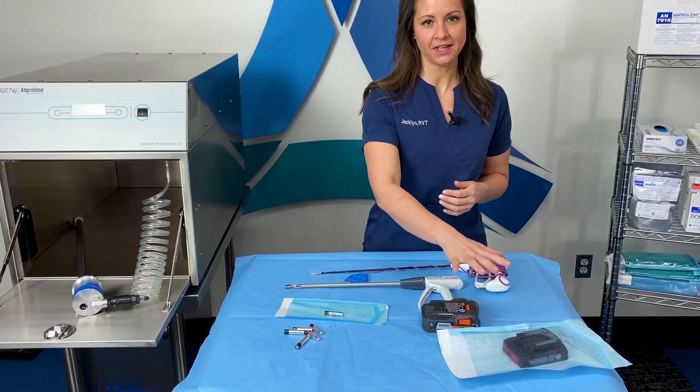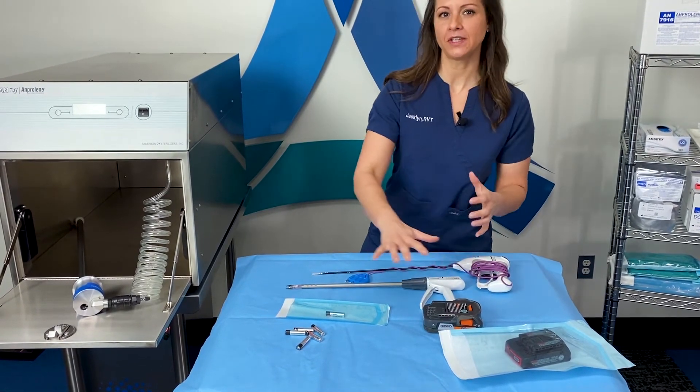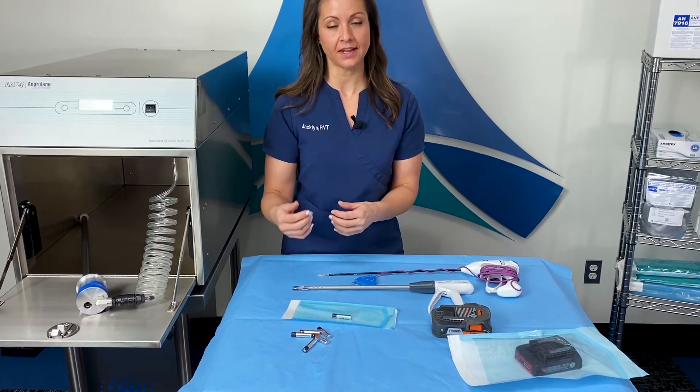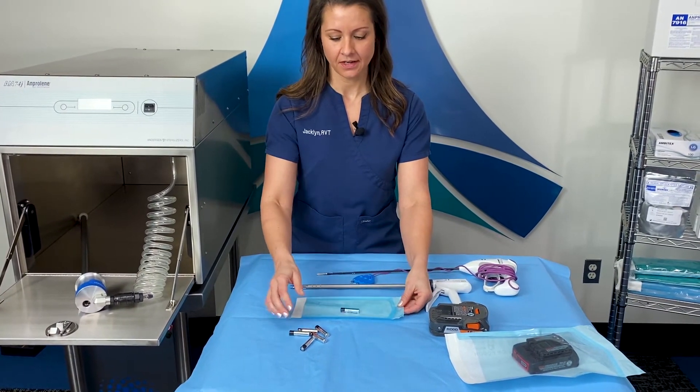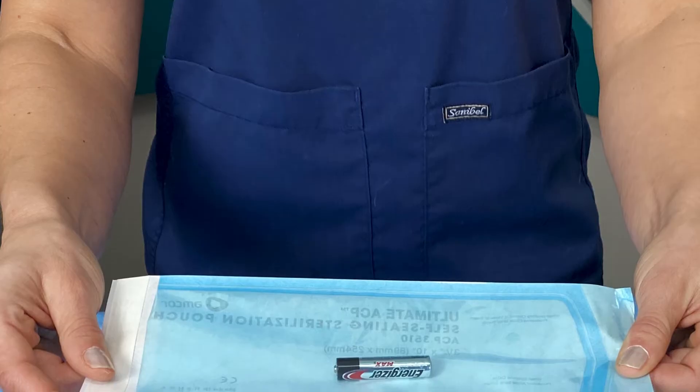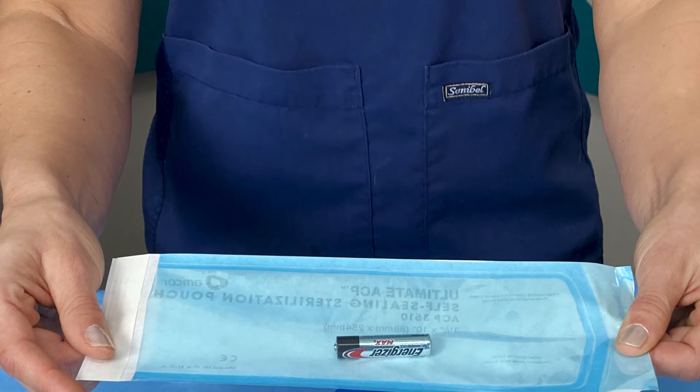With these batteries being external and part of your sterile field, there are also internal batteries inside of instruments that can be sterilized as well. The biggest thing — if there are multiple batteries in an instrument, you want to make sure that they're in a single pouch per battery.